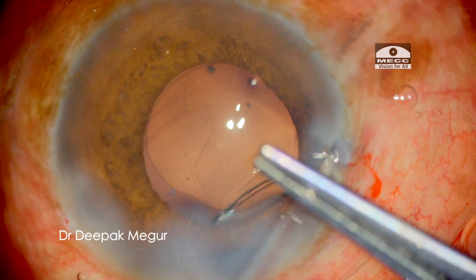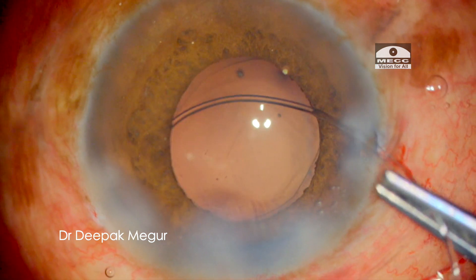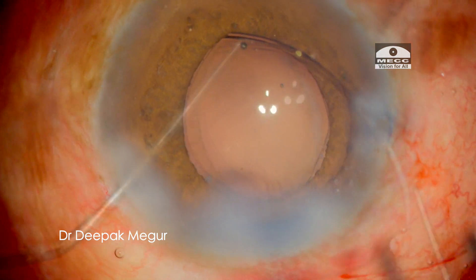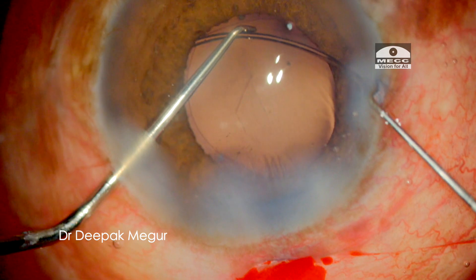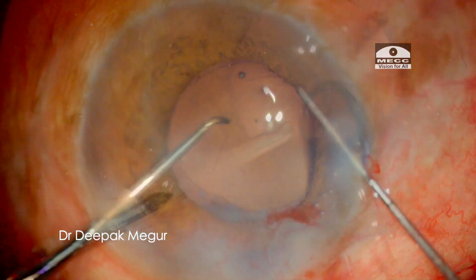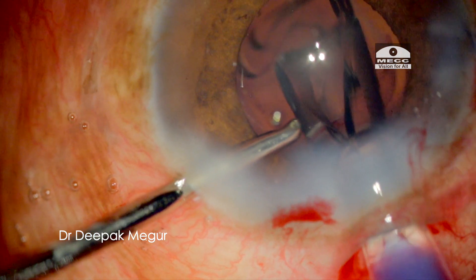Once the emulsification is done, I implant a CTR in the bag. And finally, it is time for the intraocular lens to be implanted.